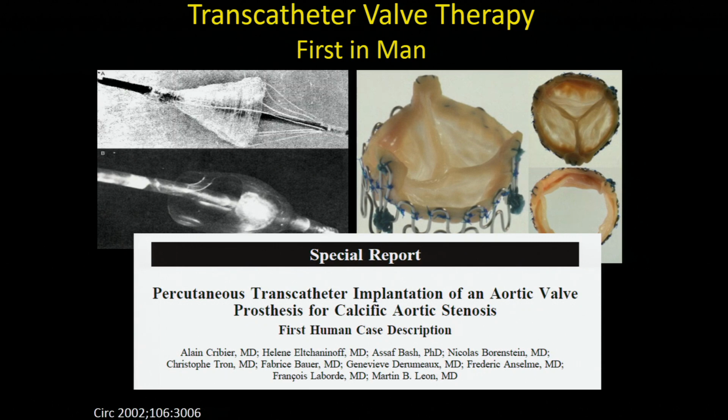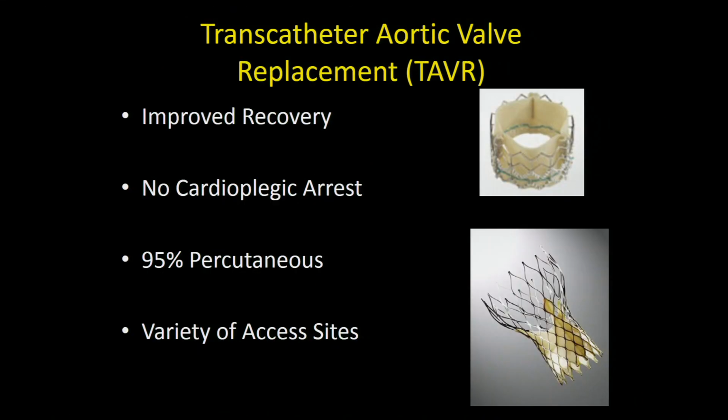In the ensuing years, we really saw more details of how this procedure would work well. So the benefits of TAVR: an improved recovery. And I think many of you may have seen our patients on the floor. They're able to get out of the hospital in 2 to 3 days compared to maybe a week after traditional surgery.